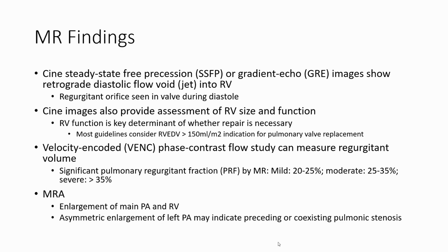MRI findings: steady-state free precession gradient echo imaging shows some retrograde diastolic flow void into the right ventricle. MRI also provides assessment of right ventricular size and function. Velocity-encoded phase contrast flow study can measure regurgitant volume. There is enlargement of the main pulmonary artery and right ventricle. Asymmetric enlargement of a branch pulmonary artery may indicate residual post-operative pulmonary stenosis.